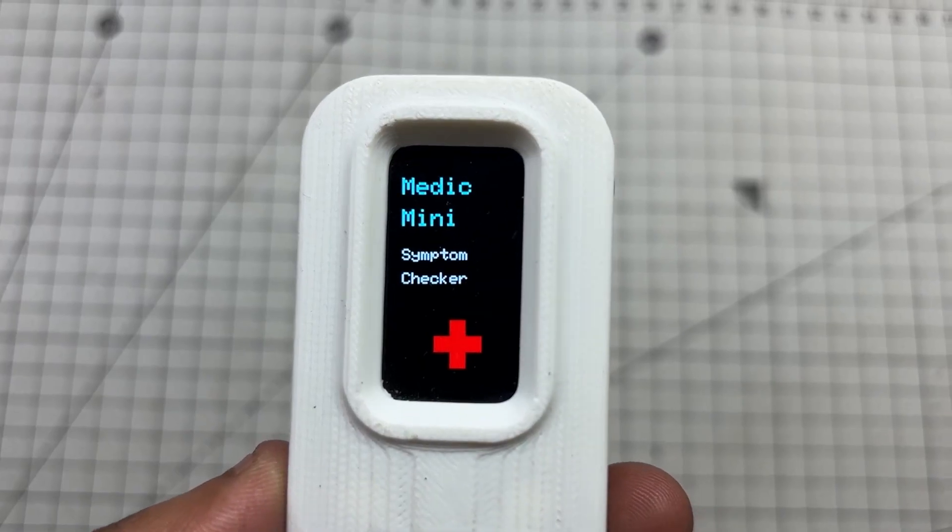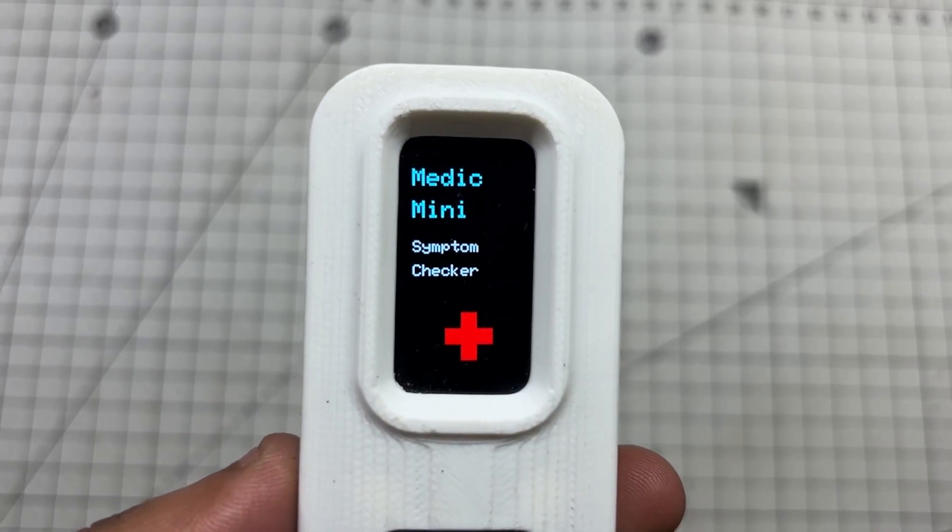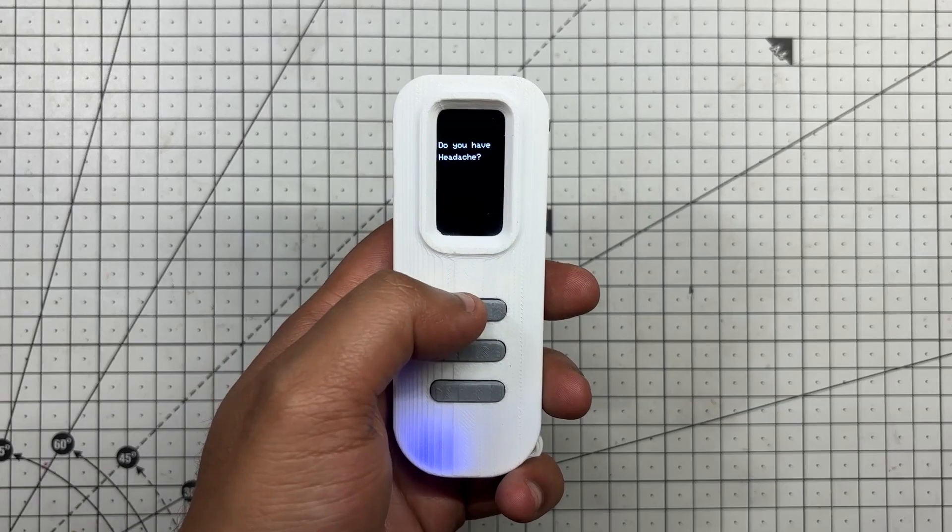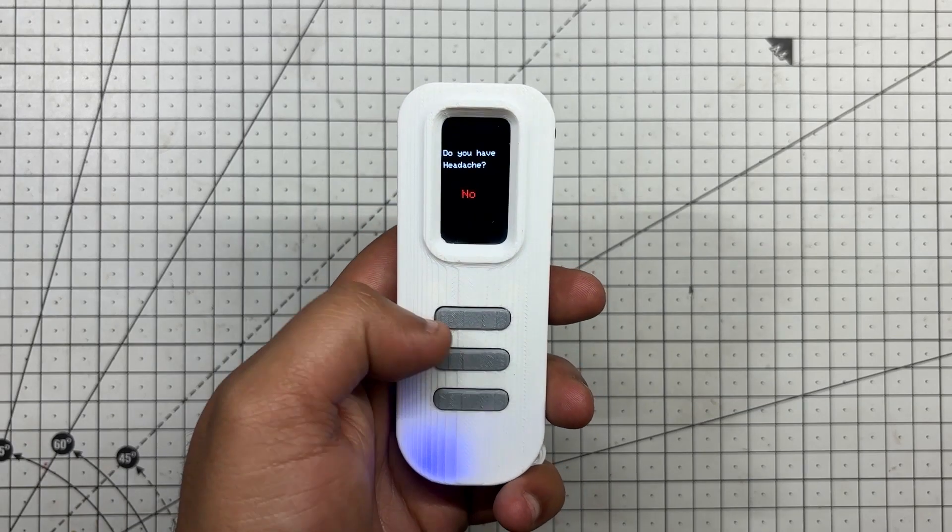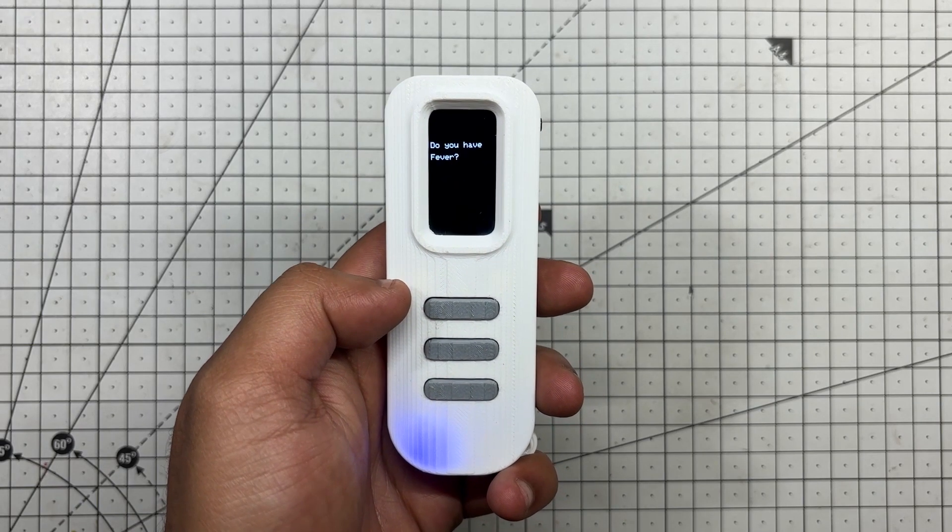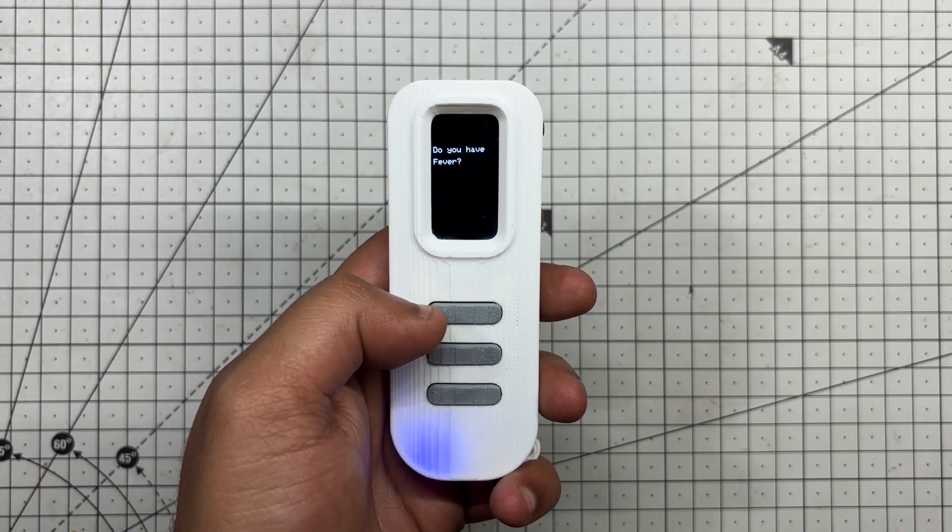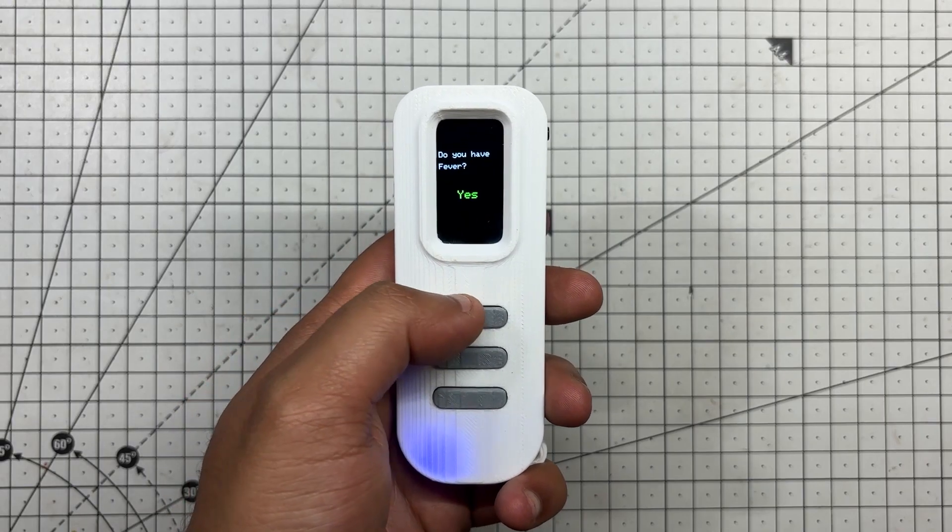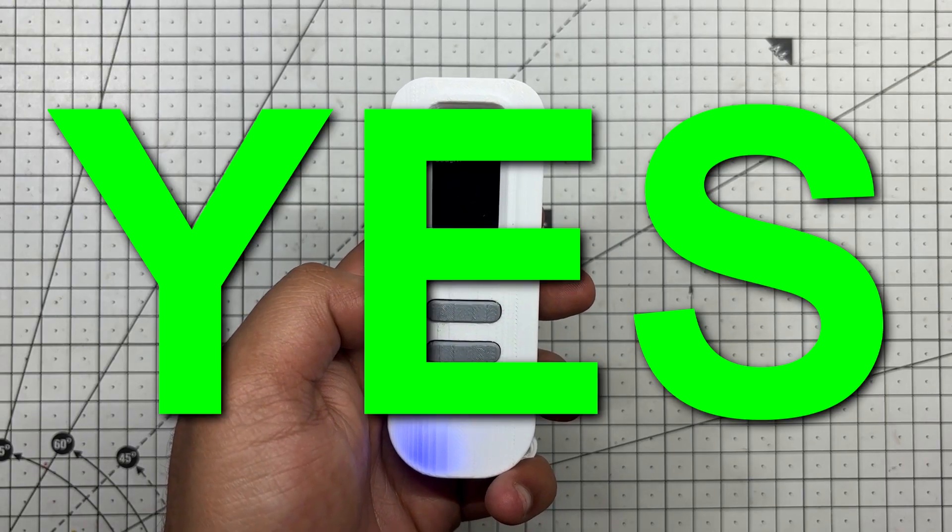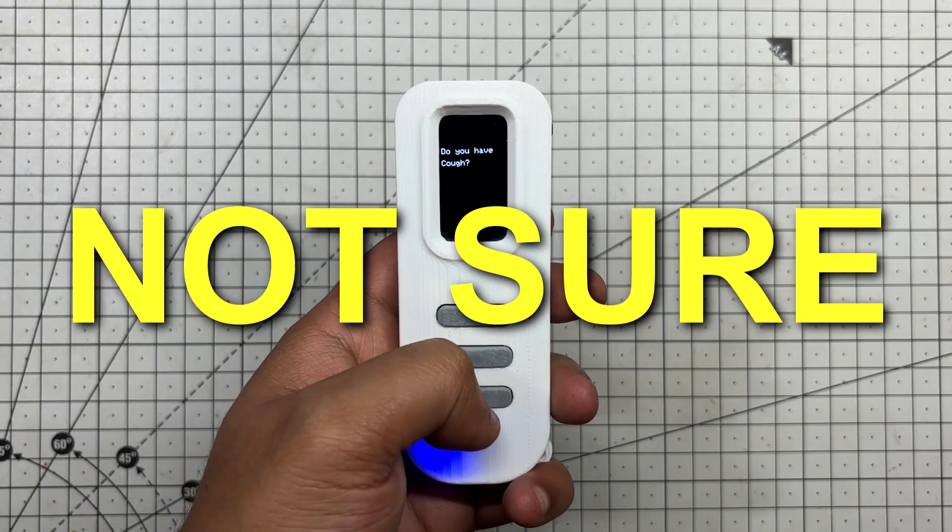The interface is clean and purposeful. Users are prompted with one symptom at a time and respond using three tactile buttons: yes, no, or not sure.